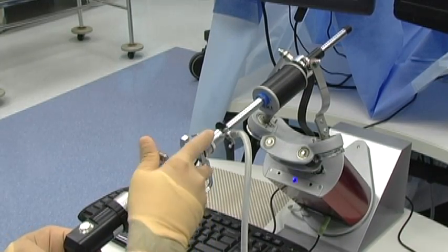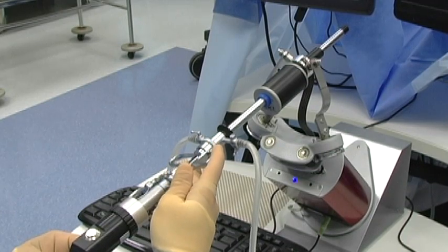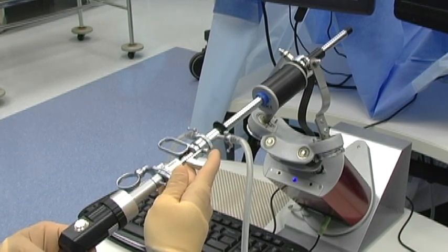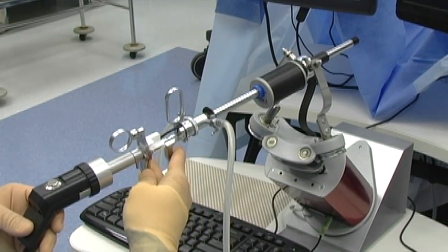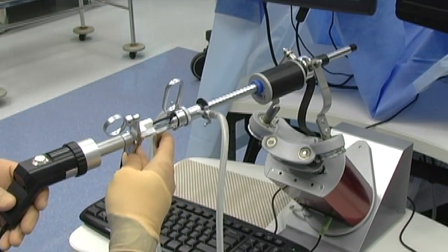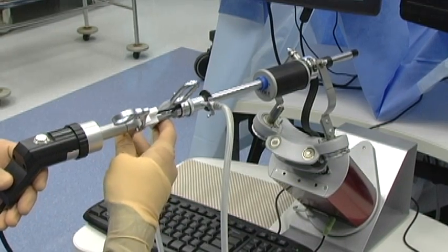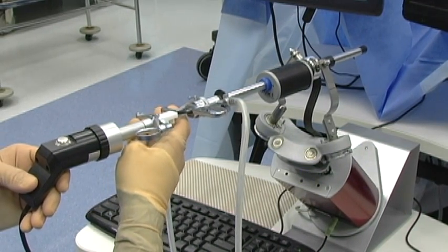You want to visualize as much of the uterine cavity as possible, so you can rotate your camera as you would do on a real-life hysteroscope. You can visualize the anterior wall of the uterus and the lateral walls as well.